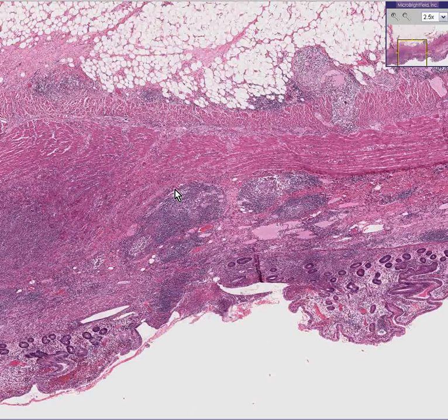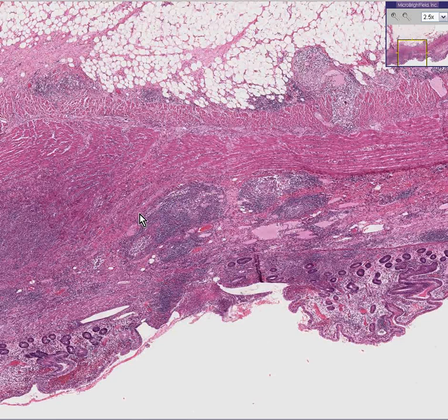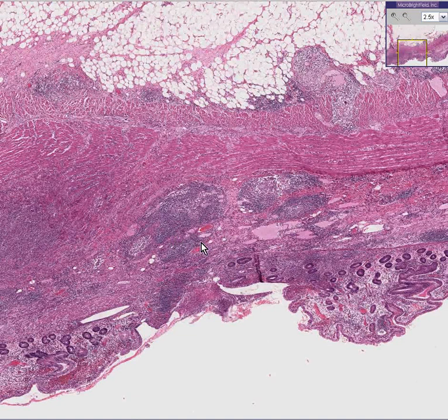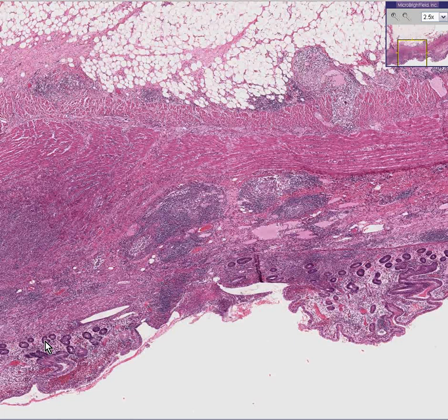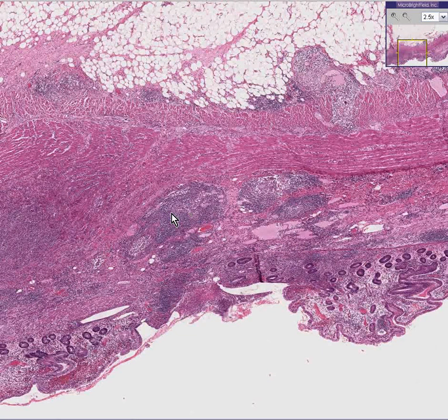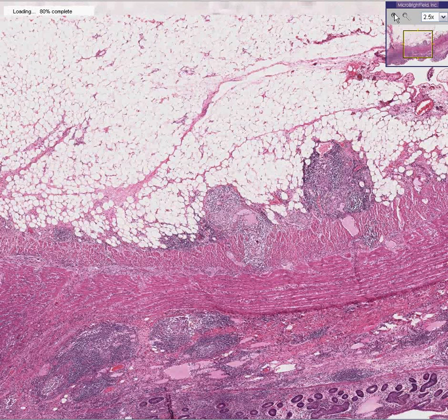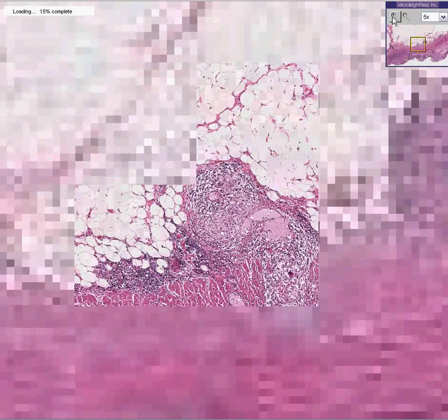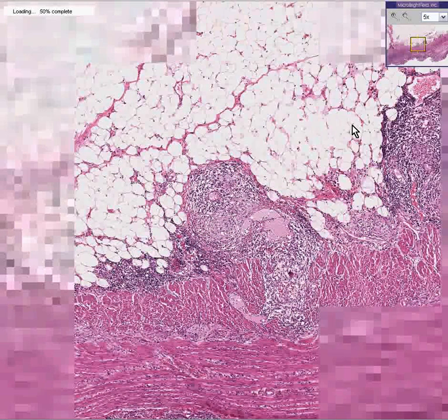A couple of microscopic things: if you see granulomas anywhere, it's probably Crohn's colitis. If you see a lot of crypt abscesses, or a lot of these colonic crypts of Lieberkühn being filled with inflammatory cells, that would point more towards ulcerative colitis. Nevertheless, you can already see this is Crohn's colitis — number one, it's in the small bowel; number two, it's full thickness; and number three, those structures out here are granulomas. So this is classical Crohn's disease.